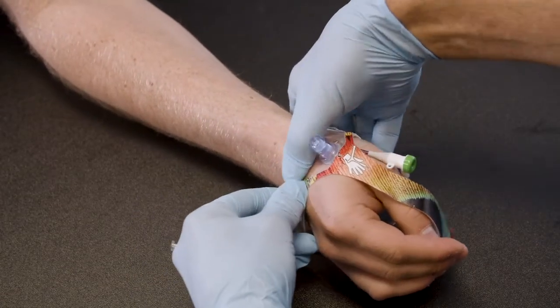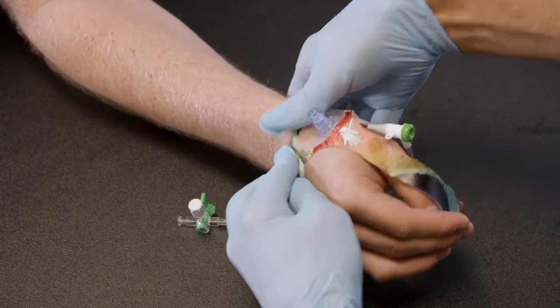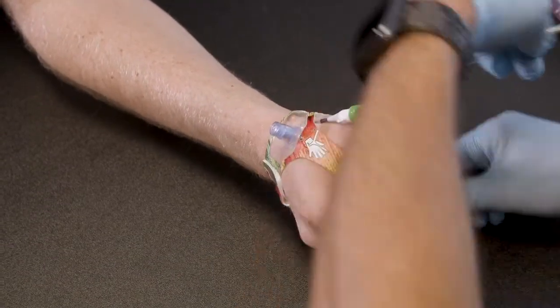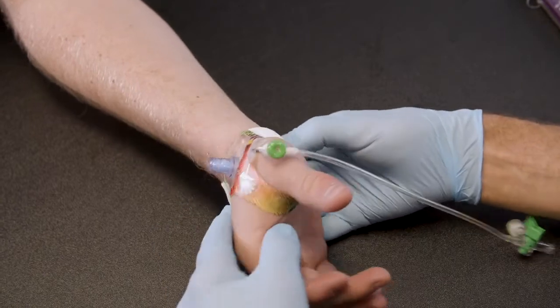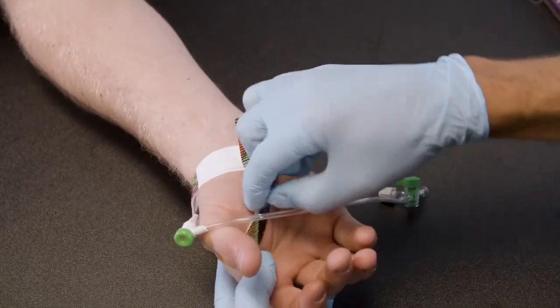Fasten band 1 and 2 tightly around the wrist. Then place band 3 around the saddle of the thumb without any slack. If the sheath is in the way of securing band number 3, then band number 3 may be secured after removal of sheath.